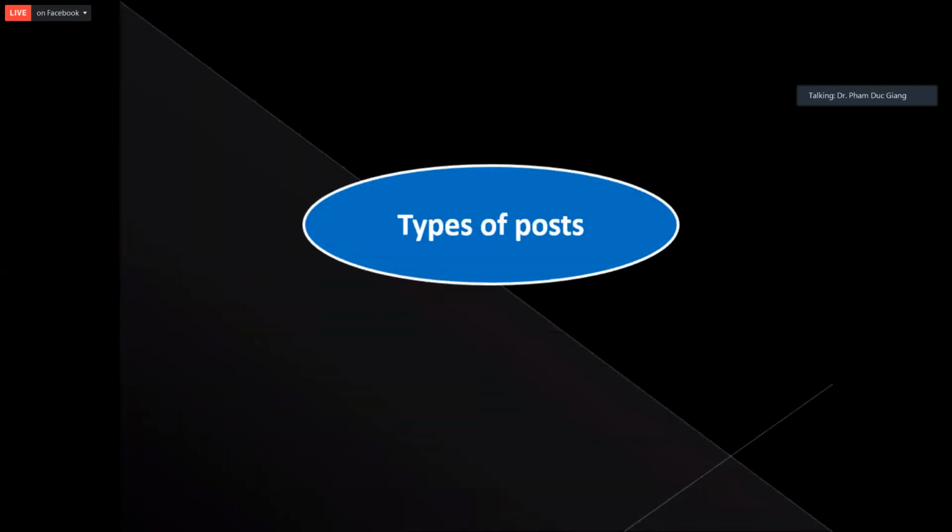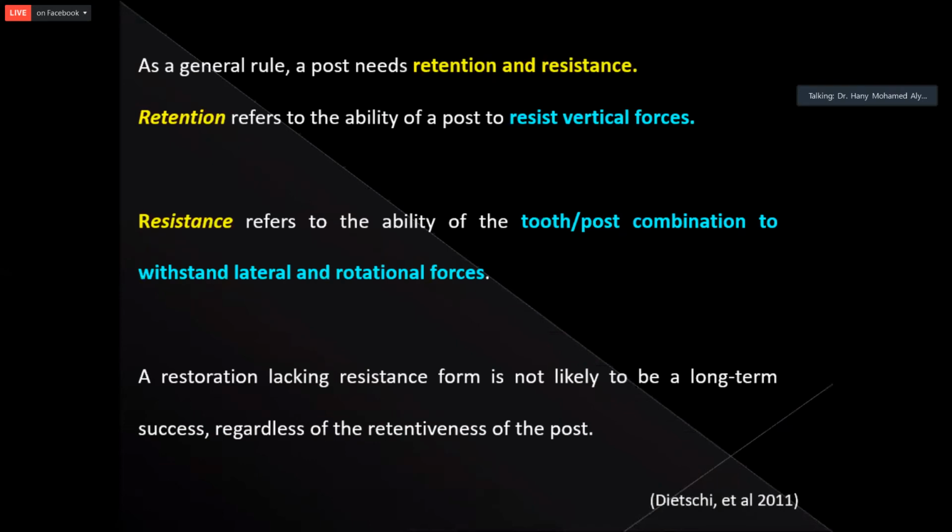Okay, so now I will move on to the types of posts.